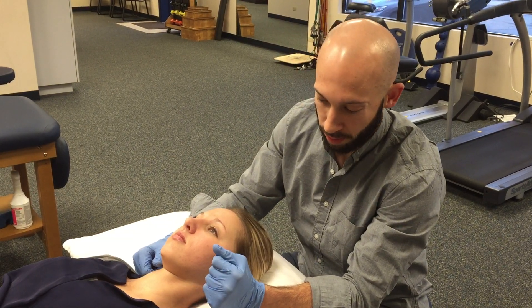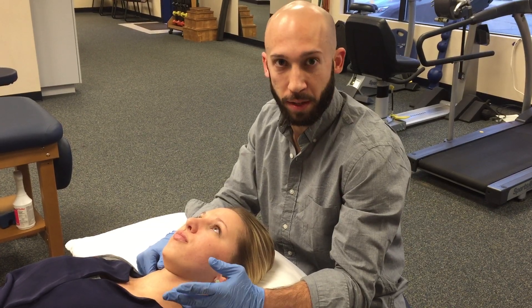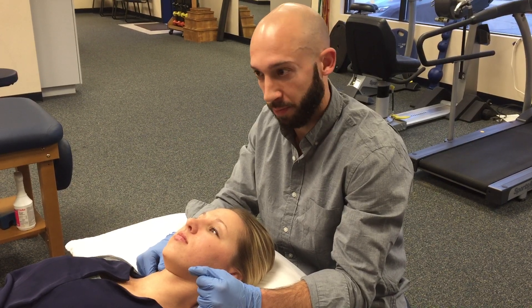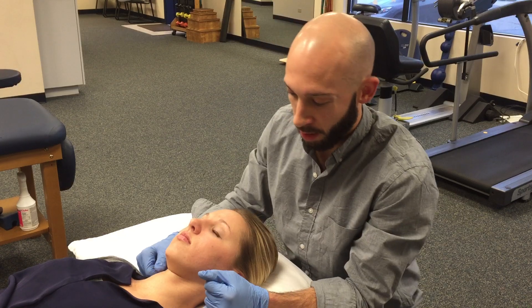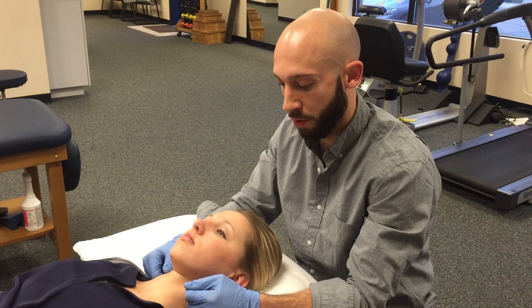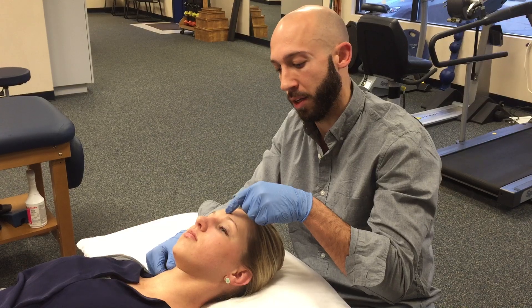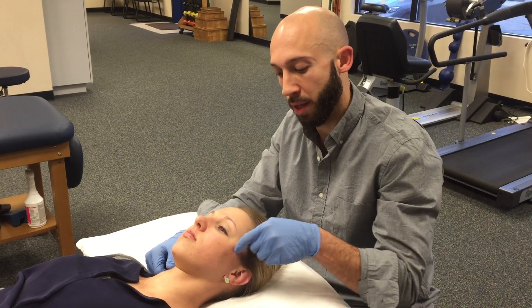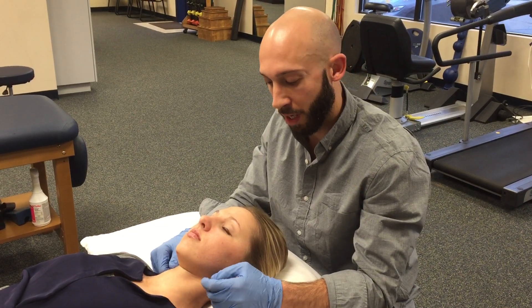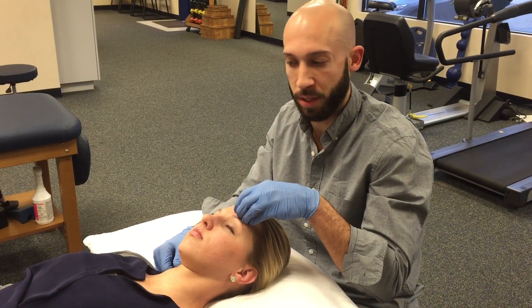The SCM has been identified as a muscle that commonly refers pain to the head in headache patients due to active trigger points, so that's why we chose this muscle. The sternal portion commonly refers to the occipital region or the temporal region on the same side, and it can also wrap around the eye like a C. The clavicular portion more commonly refers to the frontal region, most commonly also on the same side.